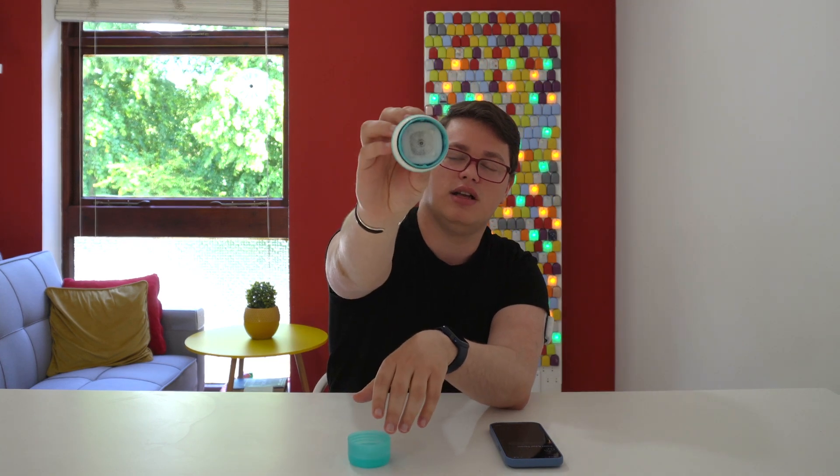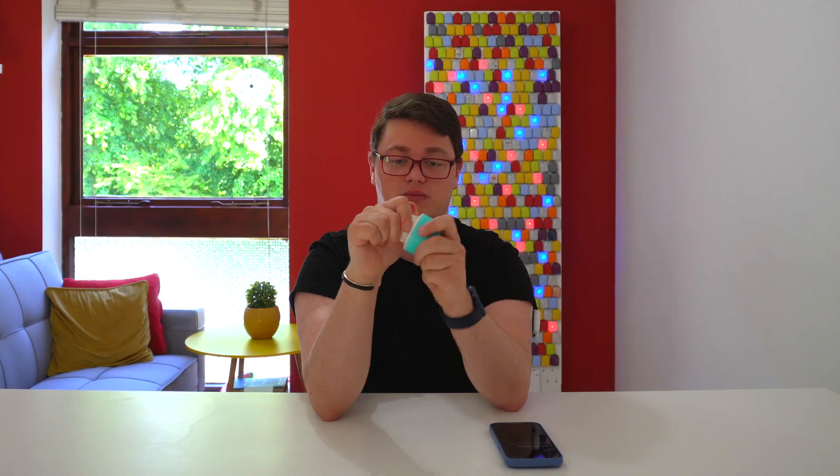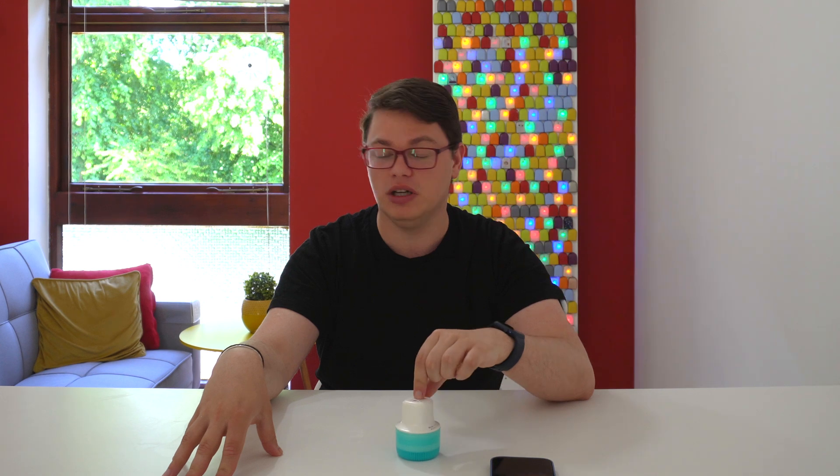This is the Medtronic Simplera CGM — Medtronic's first ever all-in-one wearable. In today's video I'll be unboxing it, applying it, and talking you through the entire setup process of what's promising to be Medtronic's biggest change to its CGM ever.